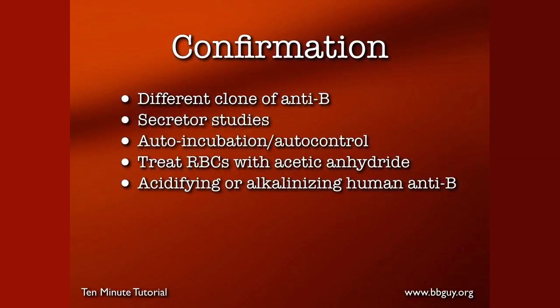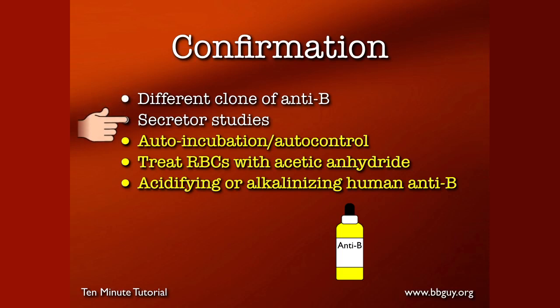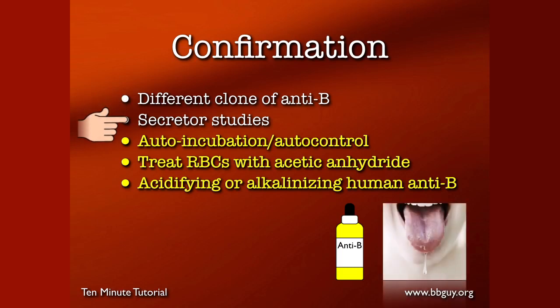Let's talk about how we confirm acquired B. First, if you have something that looks like acquired B and you happen to be using the ES4 clone, look on the package insert for your monoclonal antibody — it will typically tell you whether or not that anti-B reacts with acquired B cells. If you happen to have one that reacts, try a different clone. Second, secretor studies only works on somebody who is an actual secretor. 80% of people will secrete ABO antigens in their saliva. If you look at the saliva of a person with acquired B, you would expect to see the A antigen but not the B antigen, and so that would be helpful.